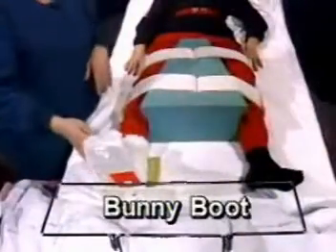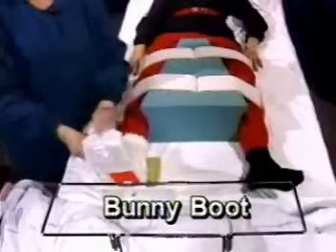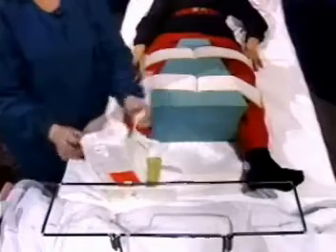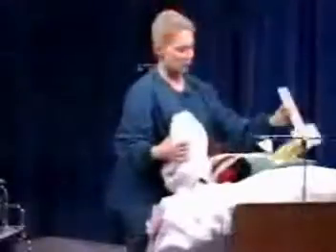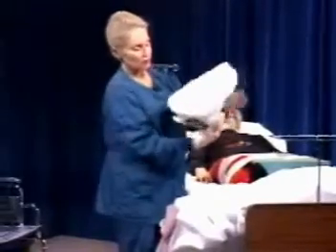On the patient right now, we have a bunny boot. A bunny boot is held to the feet with a series of Velcro straps. The purpose of the bunny boot is to help prevent heel sores and skin breakdown on the patient that is less mobile. As you can see, this came off in two pieces. It's applied on the wedge in such a manner.